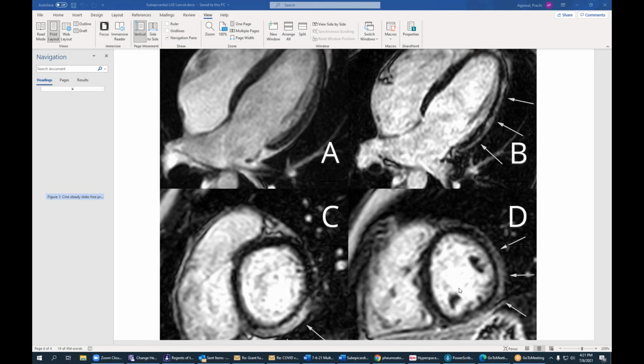Hi, Jacob. I was just going to agree with you, and I would say we have encountered the same thing. I think the problem of overcalling non-compaction exists more than undercalling it. A lot of times you just make that cut, and unless it really visually looks like it and involves several segments, a lot of times it's not truly non-compaction.